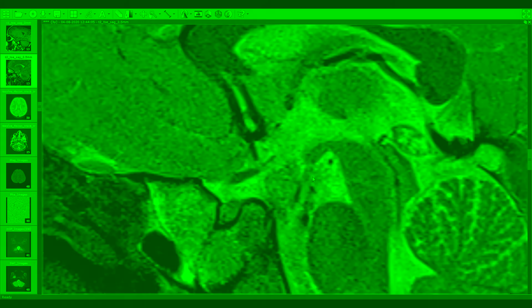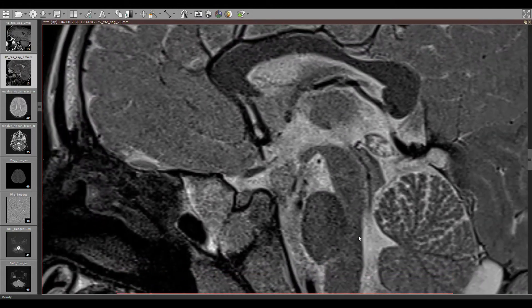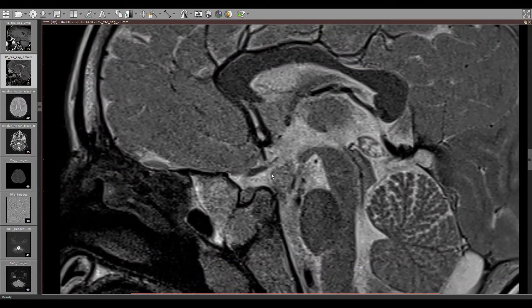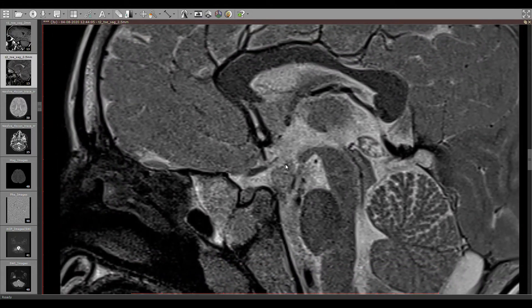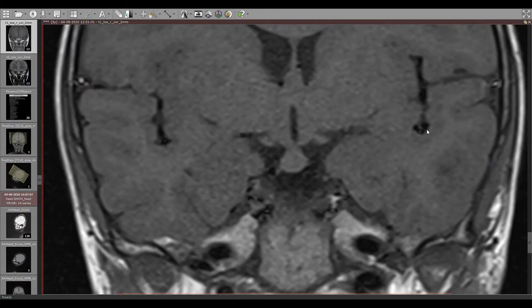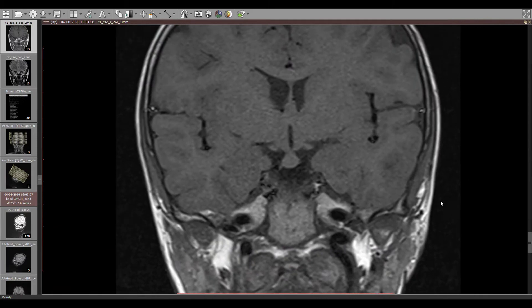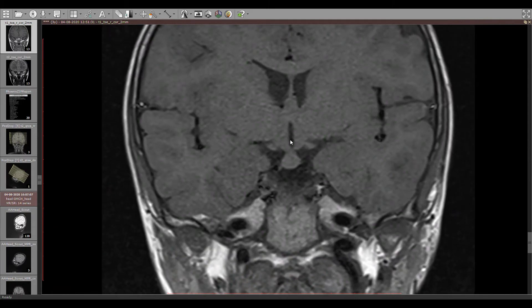On the T2-weighted images, we see that the lesion is iso-intense on T2 as well. On the coronal T1-weighted images, we see this is the region of the hypothalamus and around the inferior aspect of the third ventricle, and we see this pedunculated lesion arising from the floor of the third ventricle, which is T1 iso-intense.